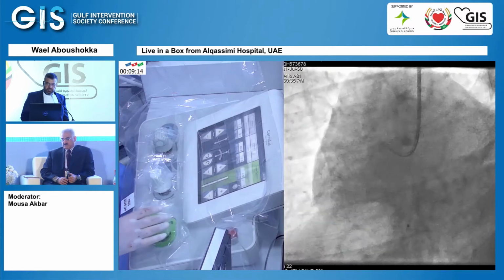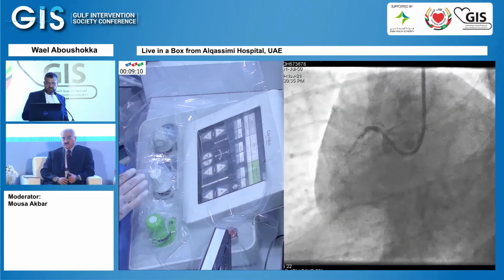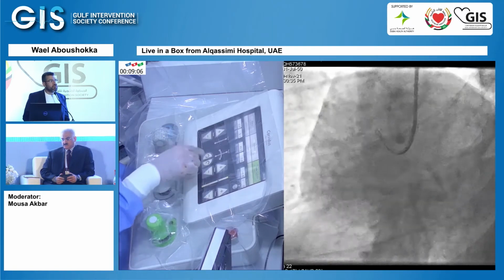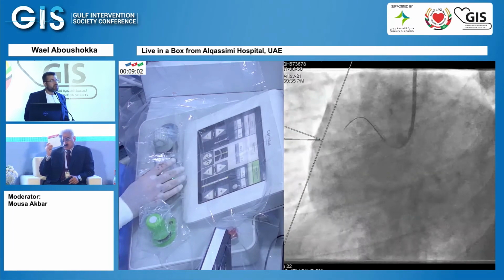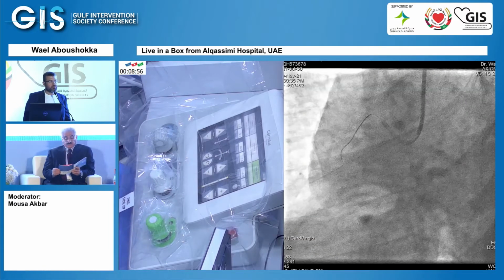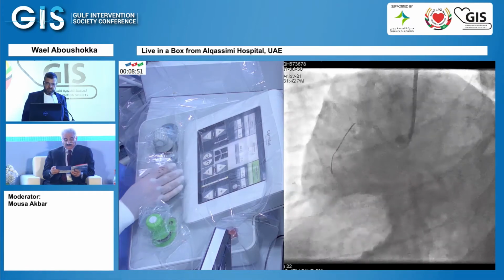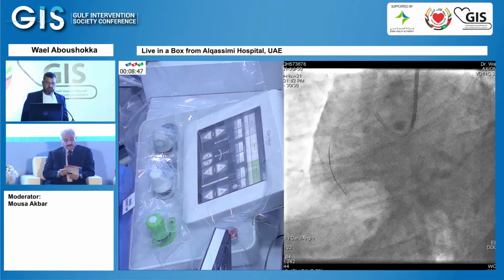Okay, so actually in the new GRX system, you can manipulate your guiding very well. You can even engage using the guiding, especially in the RCA. Just changing the guiding alignment helped us a lot to cross. And now, can I go to the PA cranial view, please?